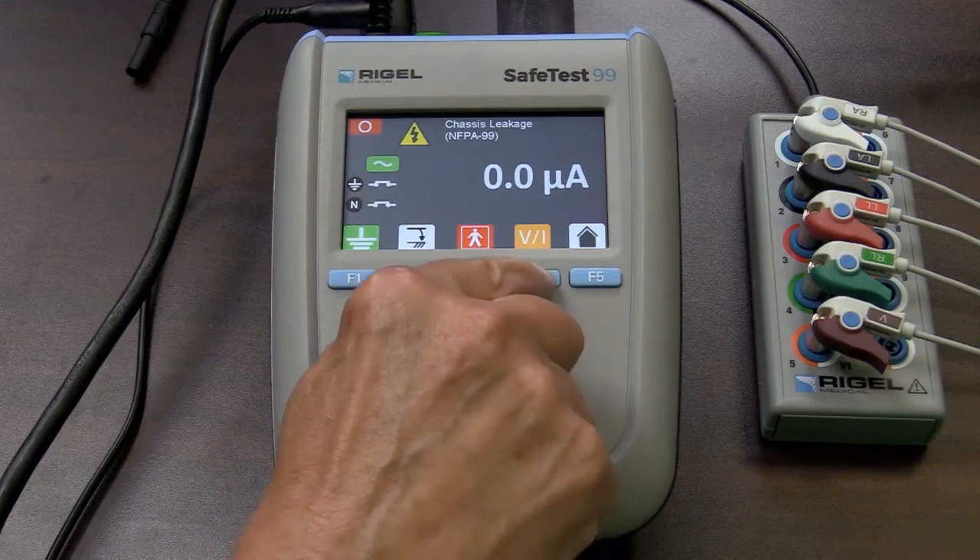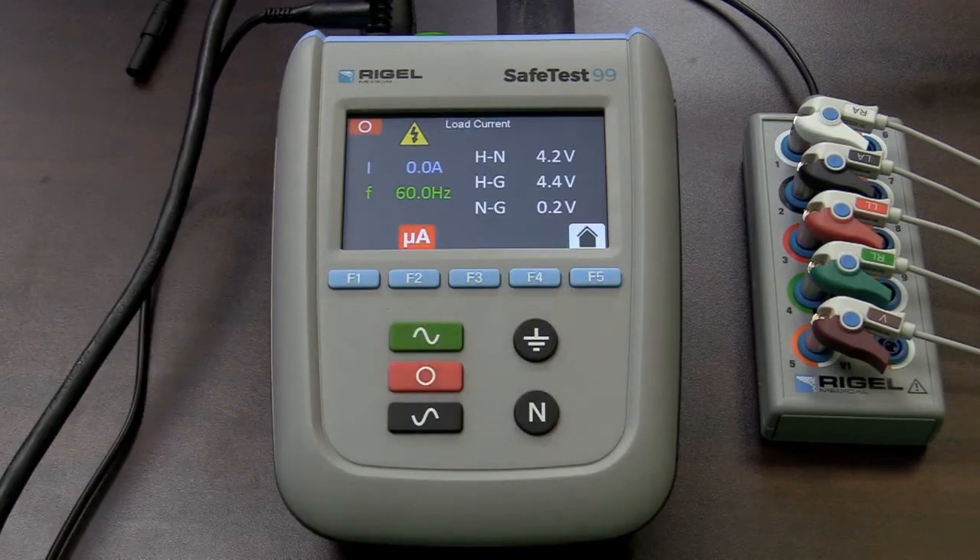While I'm here, I can select F4 for VI. That gives me the current being drawn by my device. It also gives me the voltages between hot and neutral, hot and ground, and neutral to ground. So it gives you a quick visual whether that plug is wired correctly that you're connected to within the wall of the facility. I turn the monitor on, and you see I'm pulling a little bit of current now.